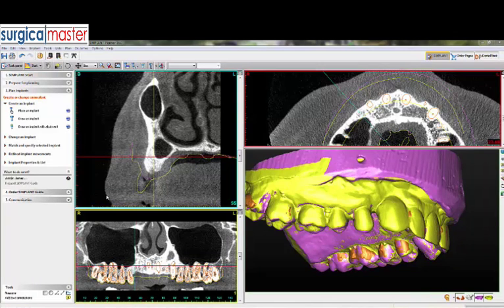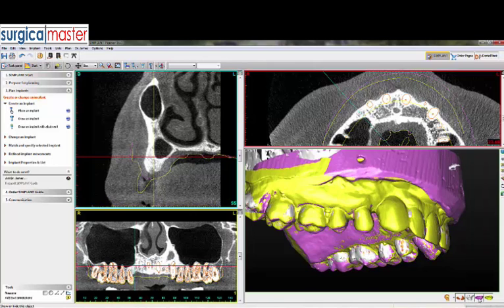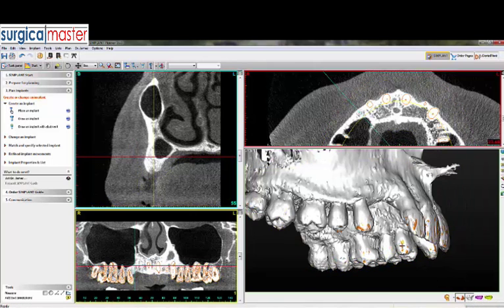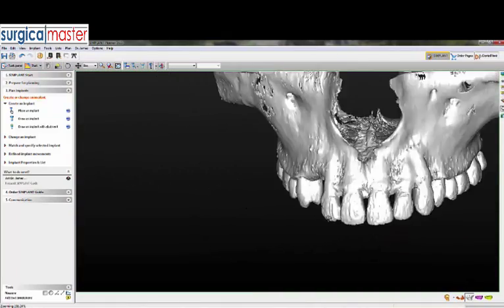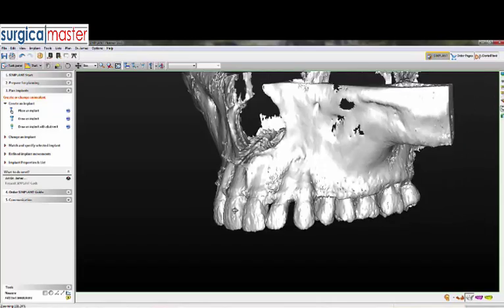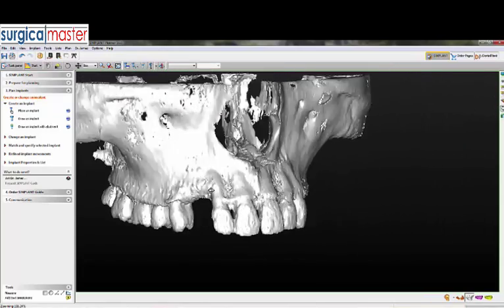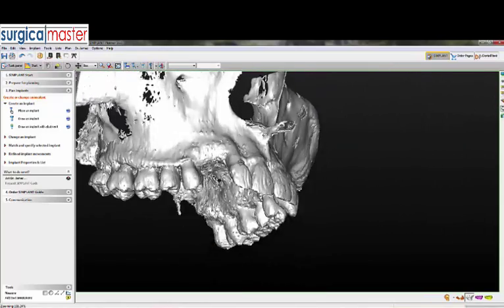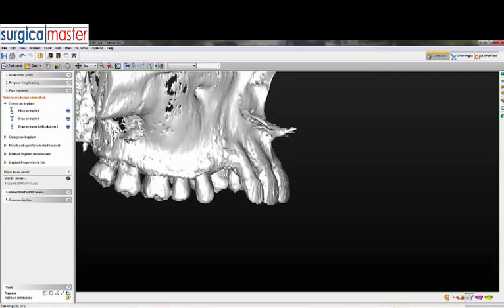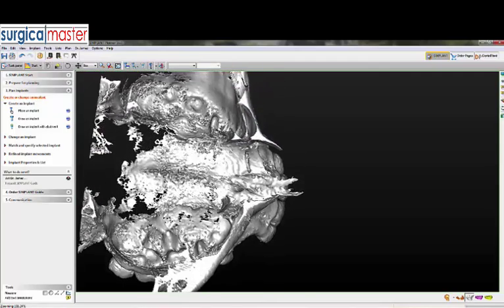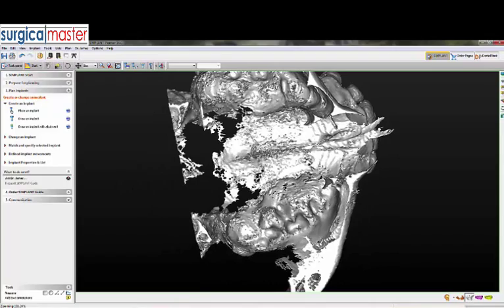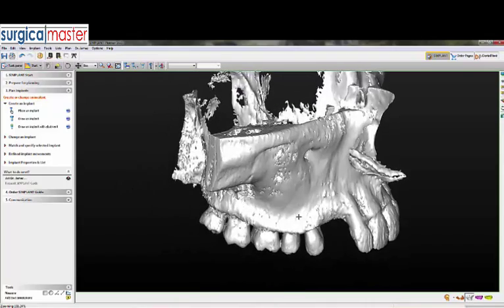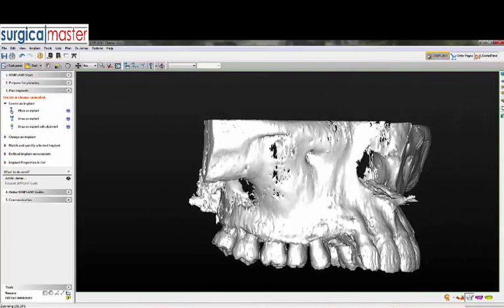We have the DICOM images and we can see the 3D rendering right here. It's easy to look at the root configuration — we see a lot of root prominence. We see some bone loss on the lateral incisor. We can also look straight into the sinus and see the roots protruding into the sinus, so we know we're going to have a sinus proximity issue in this area.